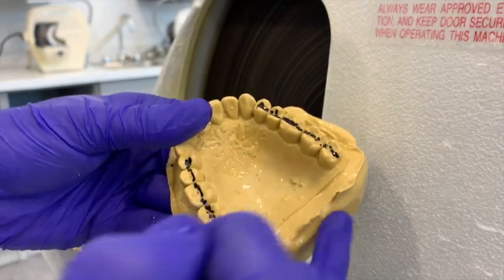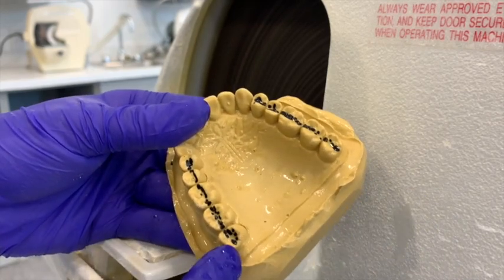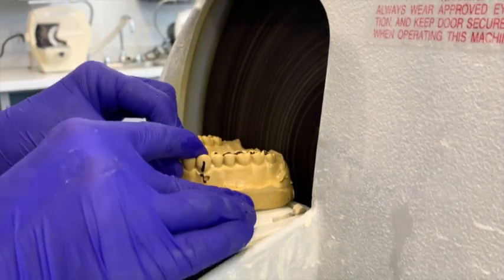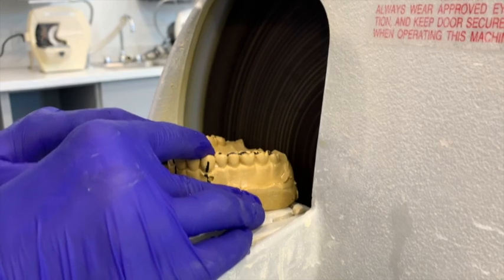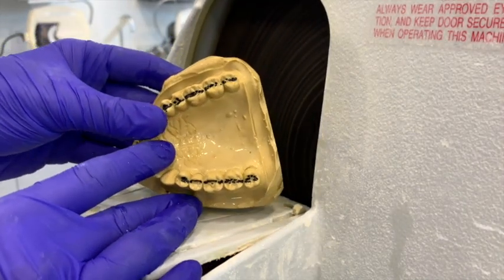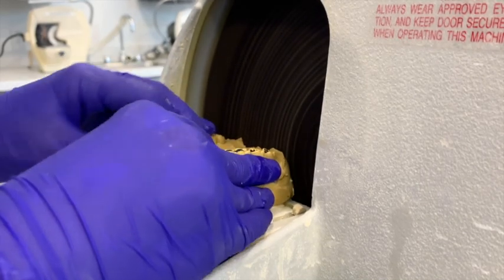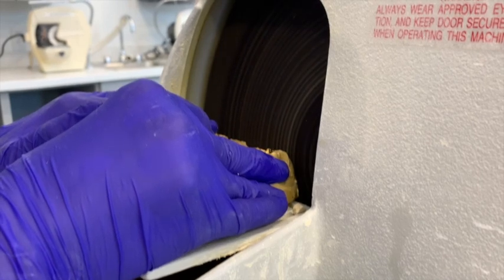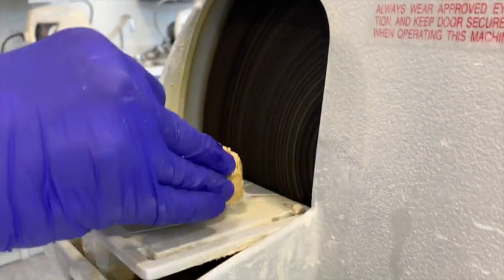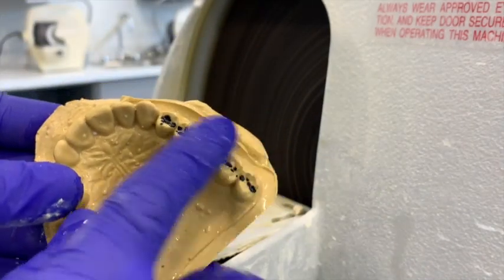Now we're going to trim our models. I'm starting with the maxillary, trimming the back edge first to get a nice flat edge. I want that flat edge to be equal distance from both distal molars. I'm lining up the back flat on the plate with the wheel and pushing against it to start trimming, watching from above at the molars to make sure I get equal amounts of material at the most distal aspect. You only need about three to four millimeters of material after the molars for your base. I rinse off the model after each pass. Now that looks pretty good — about three to four millimeters there.